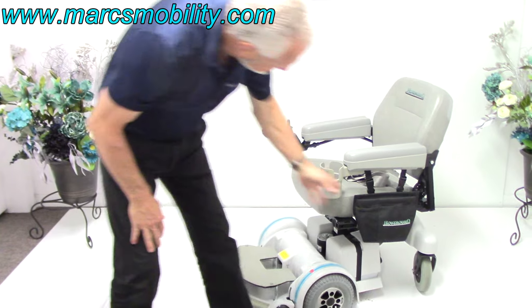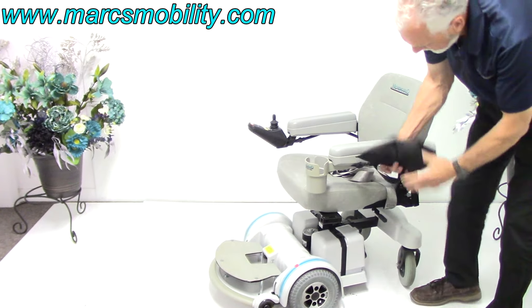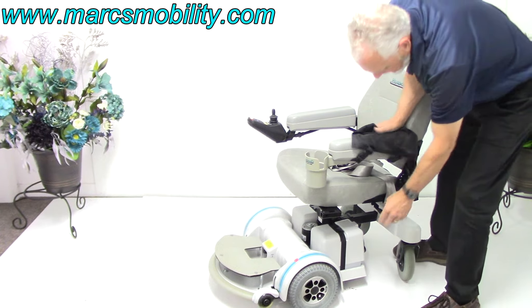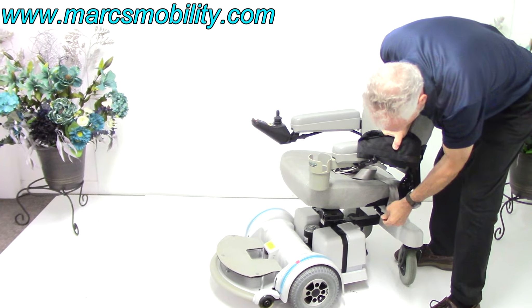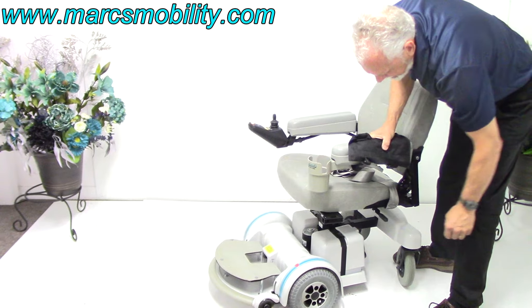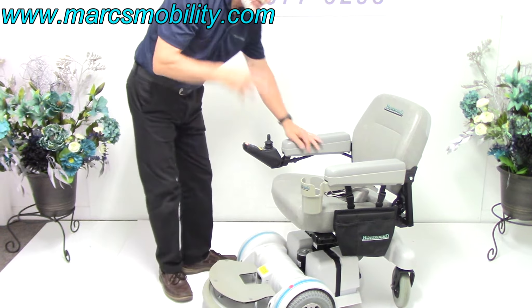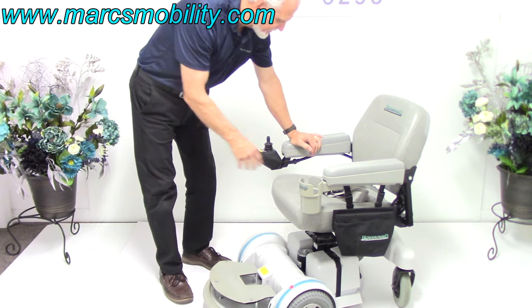The seat on this chair does swivel — I just realized that. There's a handle right here, so if you push it back, you can swivel your seat either way. So you do have a swivel seat on here, which is very important. A lot of people ask me that — does the seat swivel? Well, it does swivel on this chair.